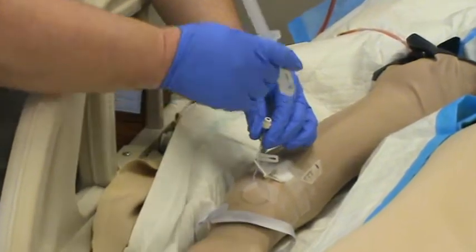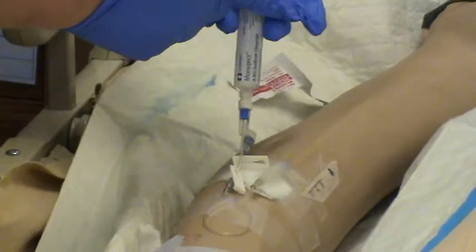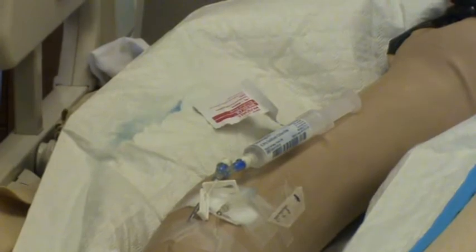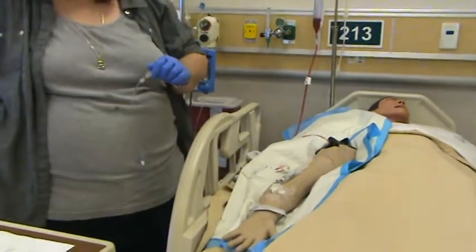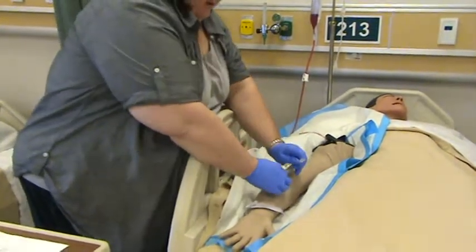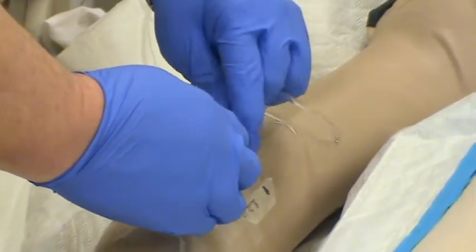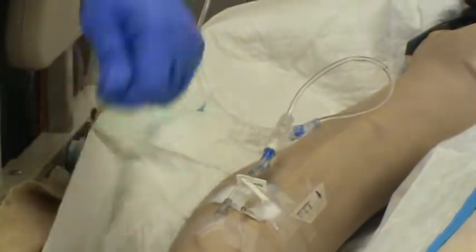I'll clean this site with alcohol. I'm going to flush this with some saline — let me know if this causes any pain. Does that hurt at all? No. The next step is to flush the lock, then remove the tubing cap and hook it up. That's hooked up and open. I'll gather up all my trash.